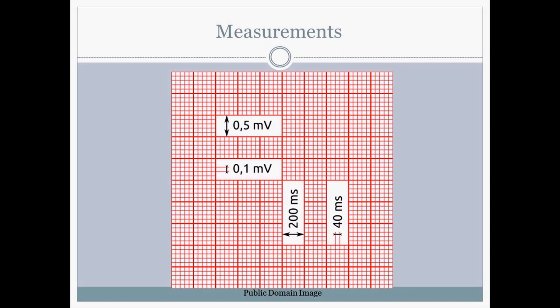Measurements. We did go over measurements in the previous lecture yesterday, and I think once a bit more of the basic understanding has been gained, the slides from that lecture will actually be very useful, and you'll start to be able to recognize what is being described on those slides. To give you a little bit more background on how these measurements are made.